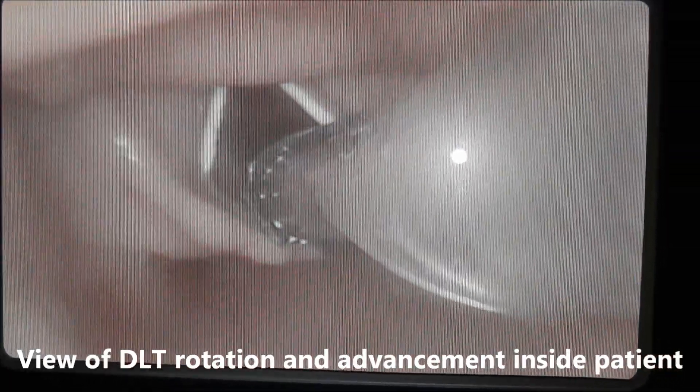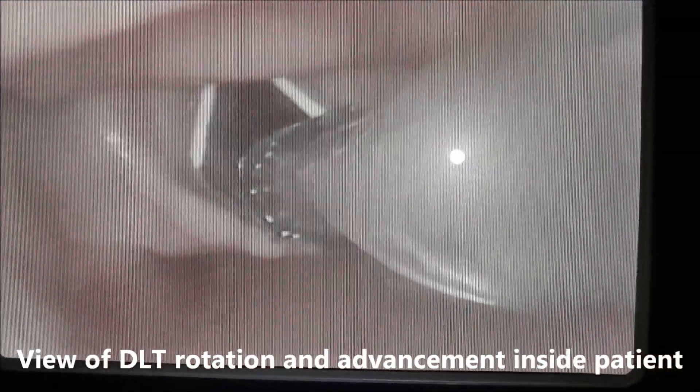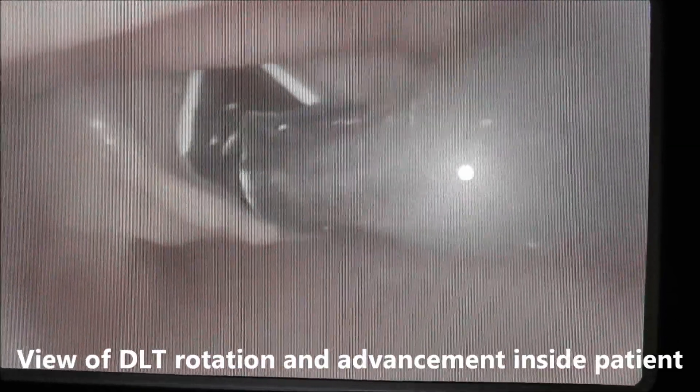From the view on the inside, you can see that once this blue cuff is at the level of the cords, we go ahead and rotate the tube to the left and have an assistant remove the stylet as we advance into the trachea.